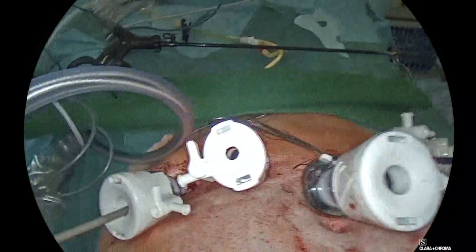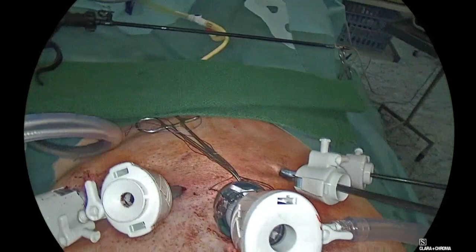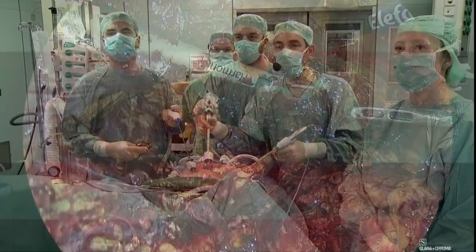Perfect. Okay. So this is the disposition of the trocars. One 12 umbilically, 5 and 12 on the left on my side, two 5s on the right side. The guy had hernia surgery. You see, this is the left side with the mesh placement, and hernia surgery on the right side without mesh placement. I had difficulties in getting into the extraperitoneal space. In fact, in the beginning, I entered the peritoneum. So I created some space.